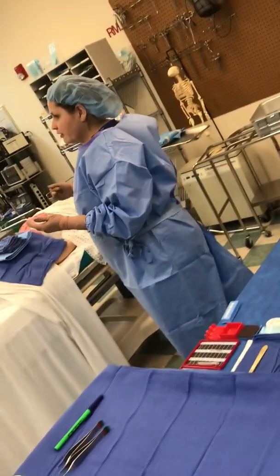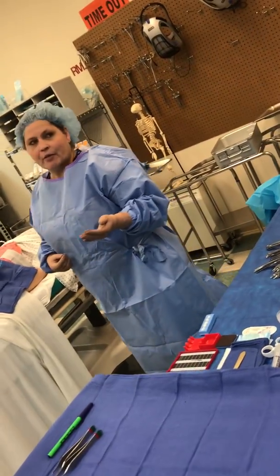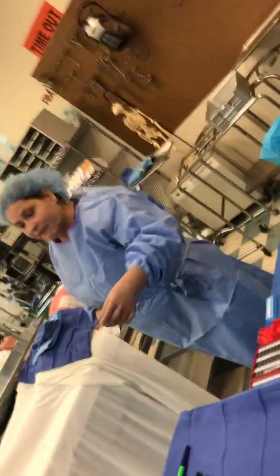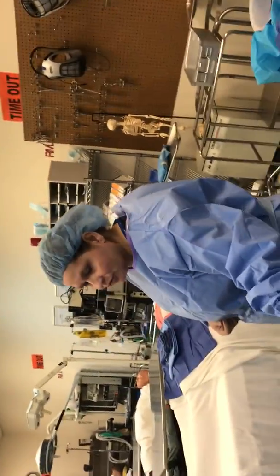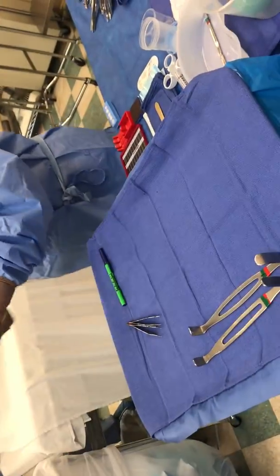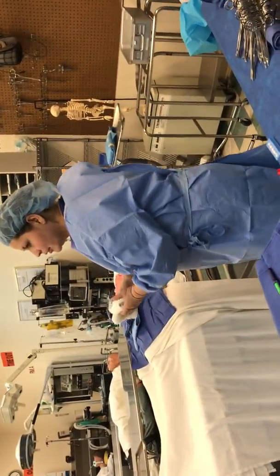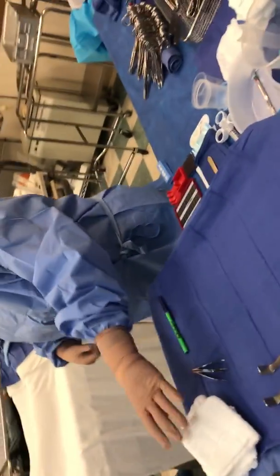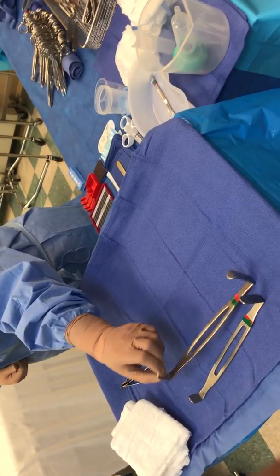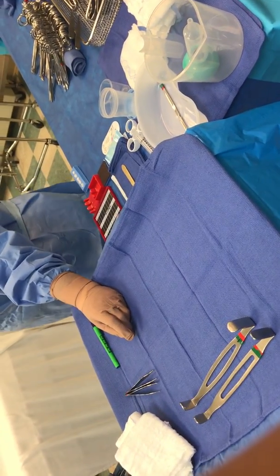Once I give him the towel, then they drape, then what? He might wanna mark the skin. They don't always mark the skin. But if he marks the skin, that should be on your mayo. Knife, when you give him the knife, marks the skin, this should be there. The 2 laps, 1 on each side. Start cutting. They want to be able to see what they're going into.